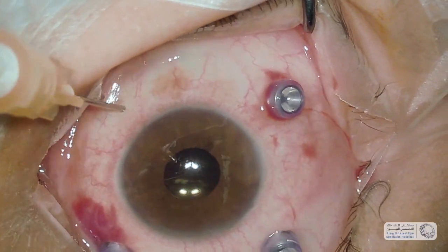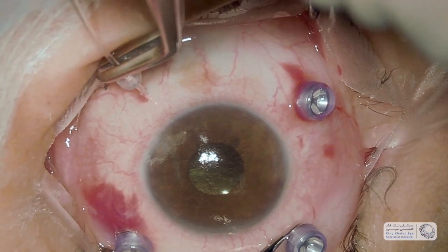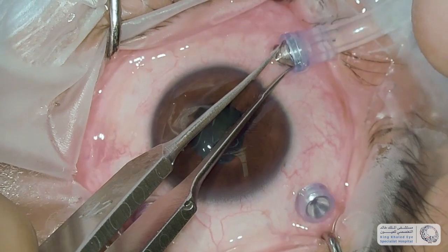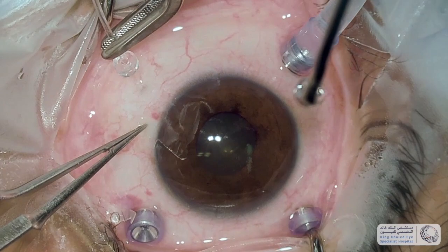I find the 23 gauge chandelier endo illumination probe very useful in most of my surgeries. I don't use trocars and I use the 27 gauge needle to insert it. In some instances I use the 25 gauge.